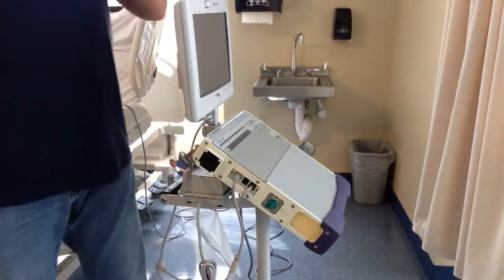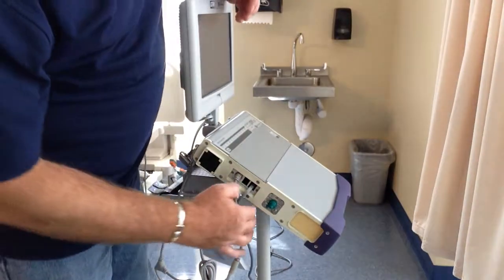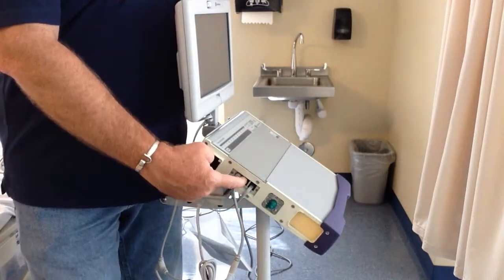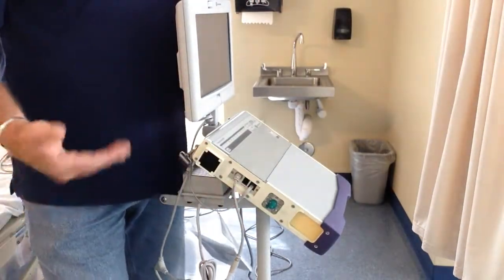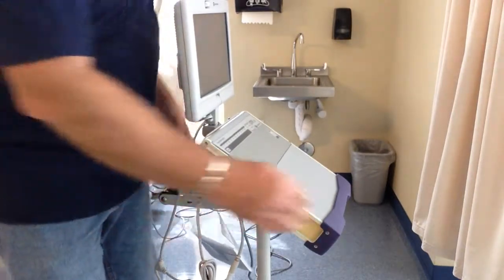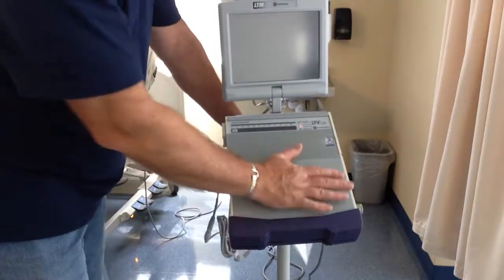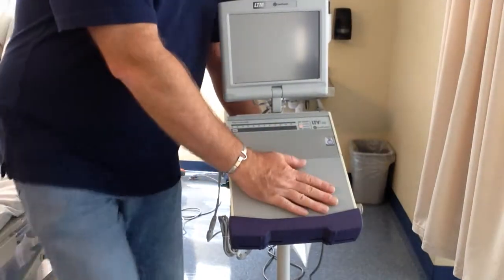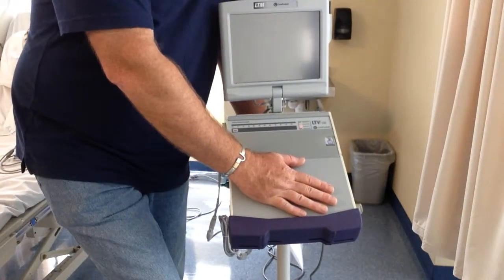This will run off blended or bled-in oxygen. You can bleed in one, two, three — whatever liters per minute that you need. This is a data download port here. If you're doing home care, sometimes you have to download data. If you're working and you feel this plate right here, it's hot — it's not going to get burning hot, but it's going to get nice and toasty, and that is normal.